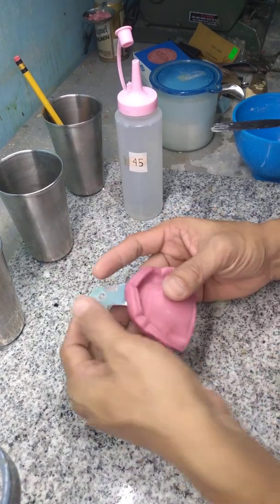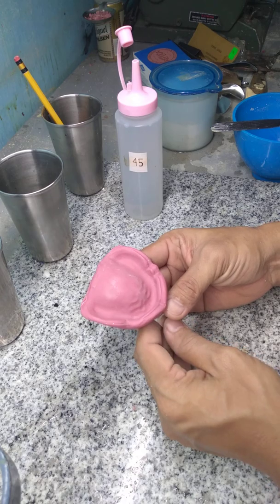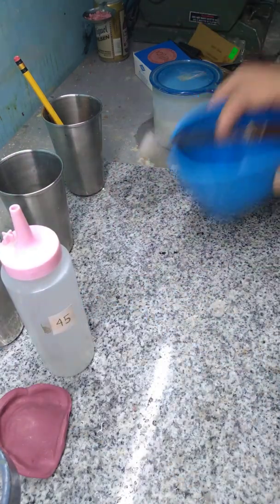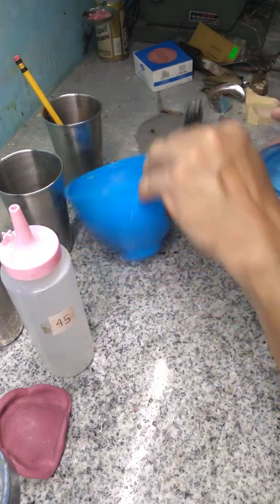When you have your impression, we're going to pour to make a diagnostic cast. Here's the armamentarium you need: water, your plaster bowl, and of course, plaster of Paris.